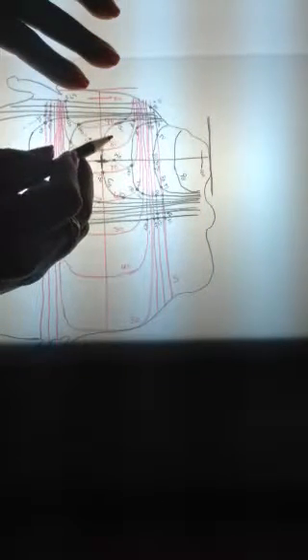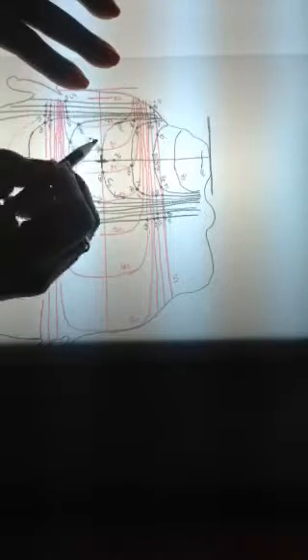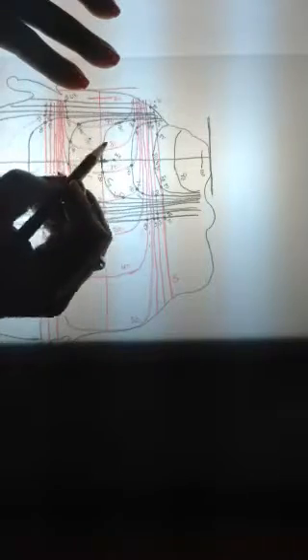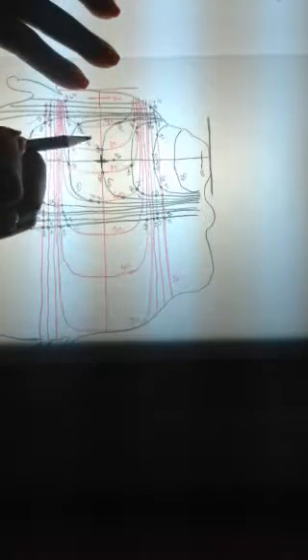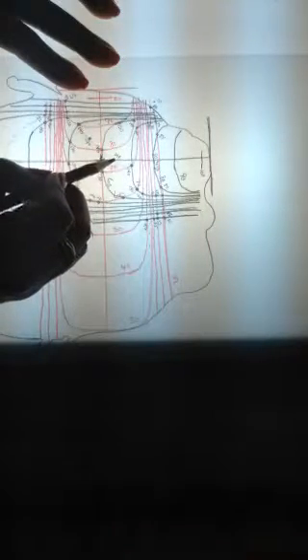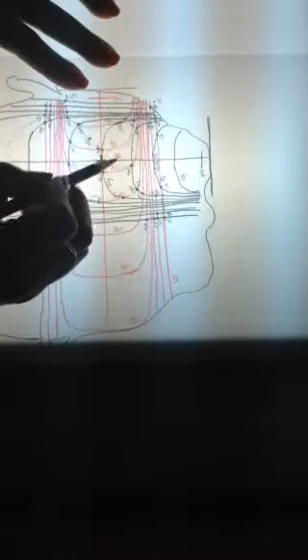So here, because there's not an 85% isodose line, does not mean it does not exist. It does. There would be about 85% coming from the lateral beam and about 55% coming from the AP beam. 85 and 55 are 140. Over here, there would be about 75% coming from the lateral beam and about 65% coming from the AP beam. 75 and 65 are 140. So we could safely assume that these points would connect this way.